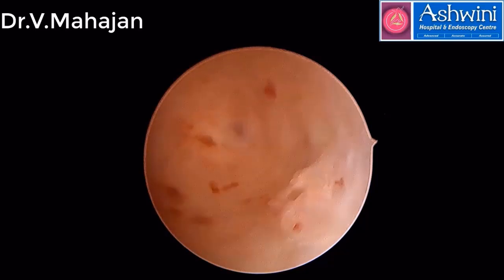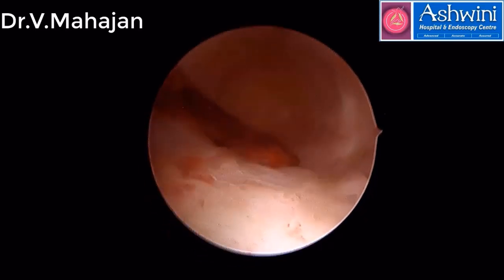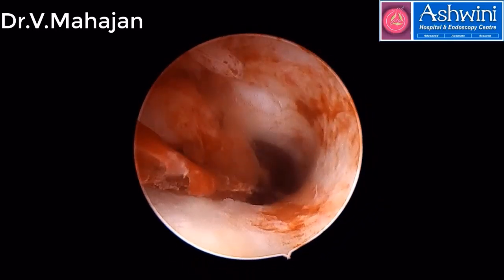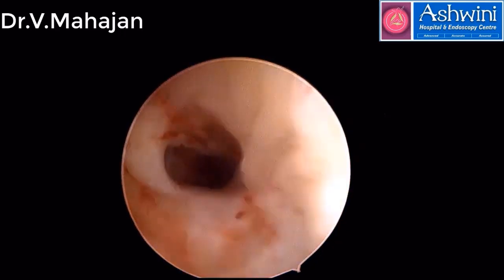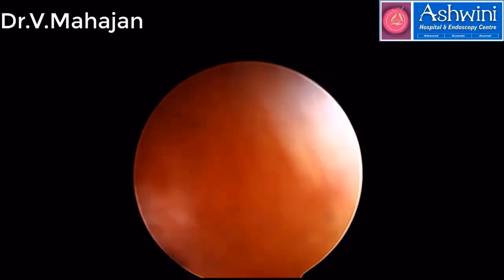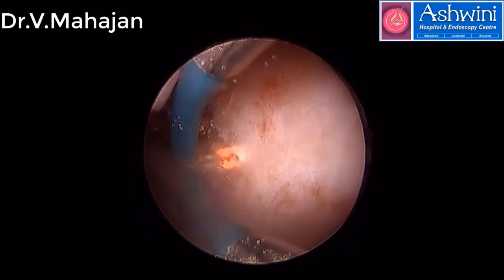As I told you, first of all, you should be able to diagnose the internal os, and the site of incision is just above the internal os. I usually use the right cavity because I find it very easy. Here the site of incision is marked and I am cutting with the Collins knife.